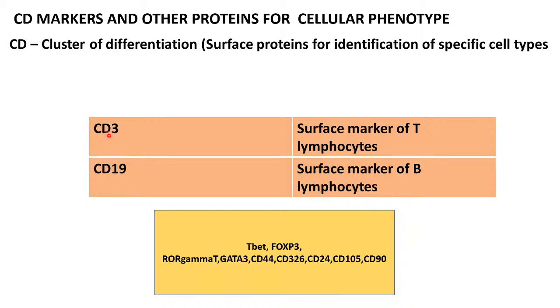And this quality checking you can do from time to time by utilizing different CD markers and flow cytometry, or some other techniques are available also, like morphology, and then checking some transcription factors, real-time PCR and all.